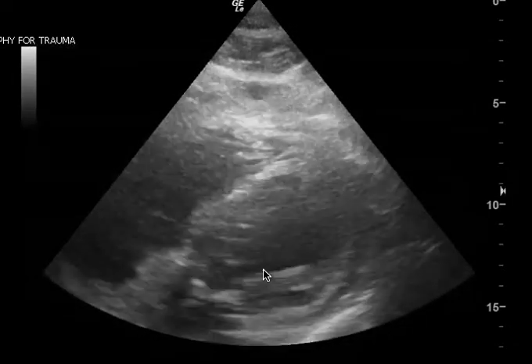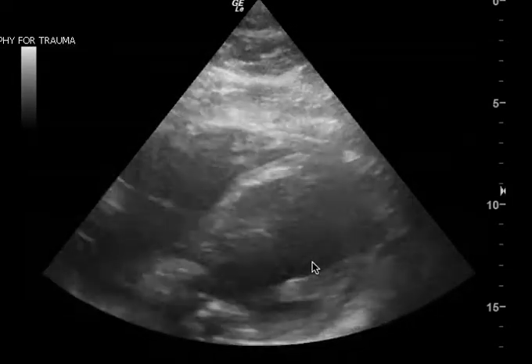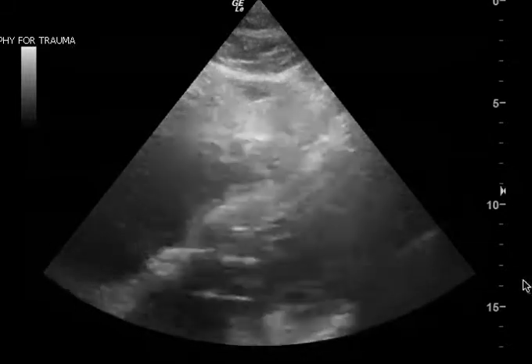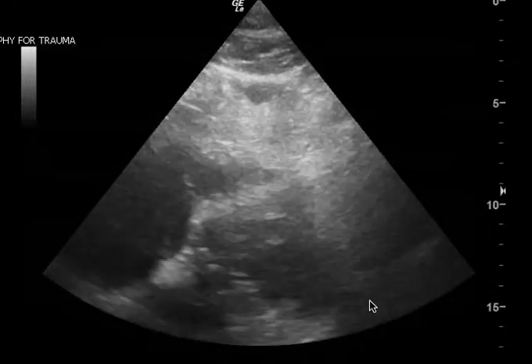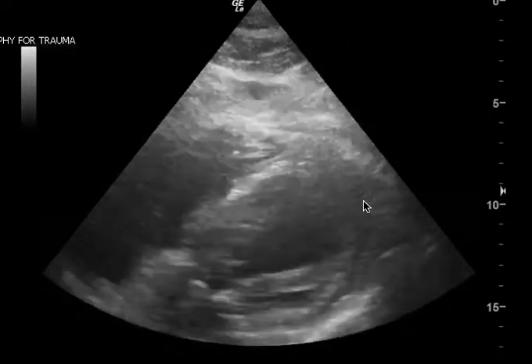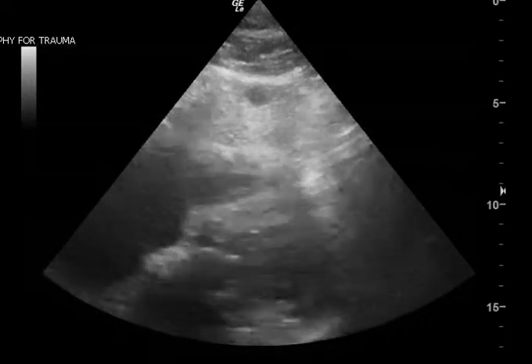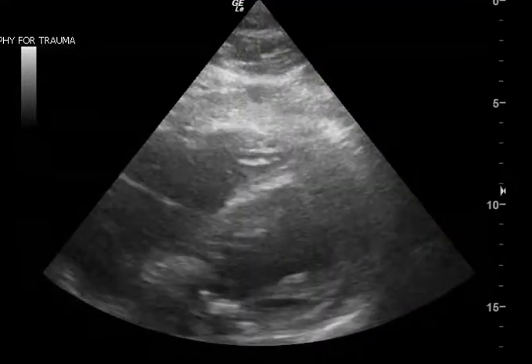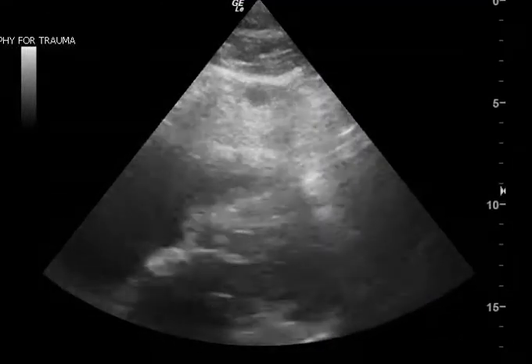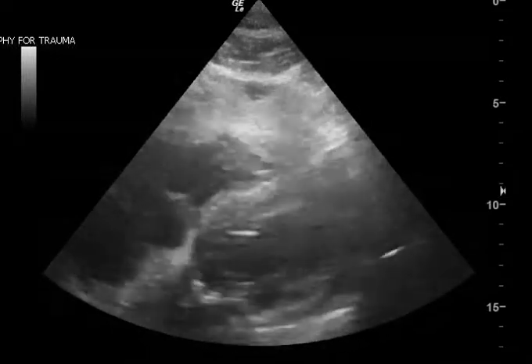In addition, just looking at this, I can't 100% tell if the ejection fraction is intact. And again, because I don't see the posterior pericardium, I'm not sure if there's a pericardial effusion. Most likely there's not, but if I had more views, I could better say. But I have lung views here, there's the heart, and then the IVC. So this is the only cardiac view I have, so I think it's limited.